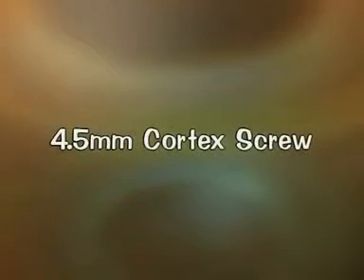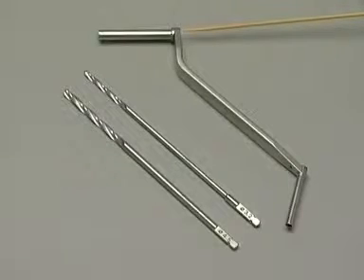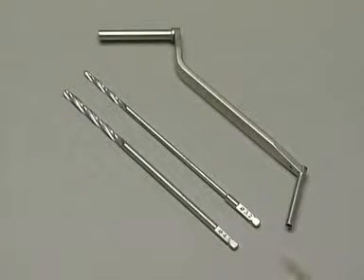The 4.5 mm cortex screw. For this exercise, the following instruments and implants are required. The 4.5 mm drill bit with the double drill sleeve 4.5/3.2, and the 3.2 mm drill bit with the same drill sleeve.